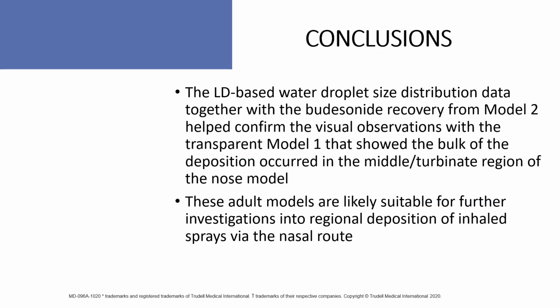The measurements reported in this presentation provide a preliminary validation of these identical anatomically correct models of an adult nasal cavity. The transparent Model 1 allows for rapid visual interpretation of the likely deposition profile. The opaque Model 2 is suitable for quantitative measurements of drug particle deposition by an appropriate assay technique. Further studies will include evaluations with nasal sprays and aerosol sources, producing a range of different size distribution profiles.